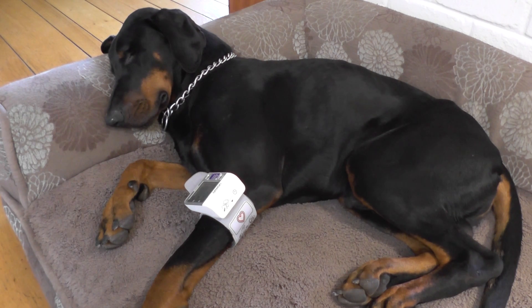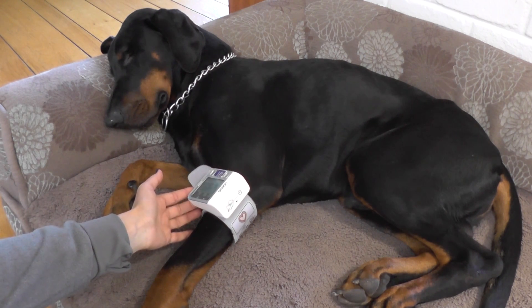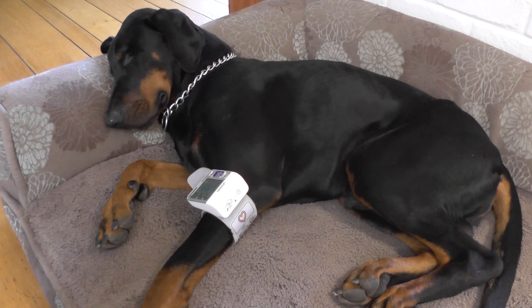For dogs, they only care about the higher number, which is the systolic measurement. The diastolic measurement, which is the lower number, can't be accurately detected for some reason, so it's just disregarded.